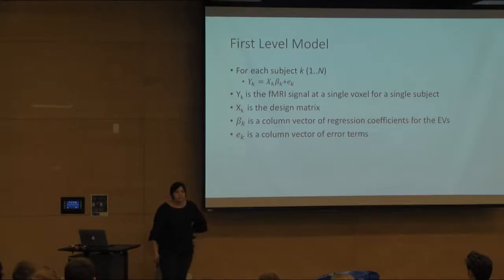What have I left out of this? What else do you model, typically? Throw something out there. What's in your design matrix? It was a very simple design matrix. Sorry? Motion parameters. Did you say? Yeah? Exactly. Motion parameters. What else might you put in there? Reaction time? If you're interested in something related to the reaction time specifically, yes. If you're interested in the age, yes. So covariates, you're including covariates, yeah. I'm thinking about all the other nuisance parameters that you might include in there, right?